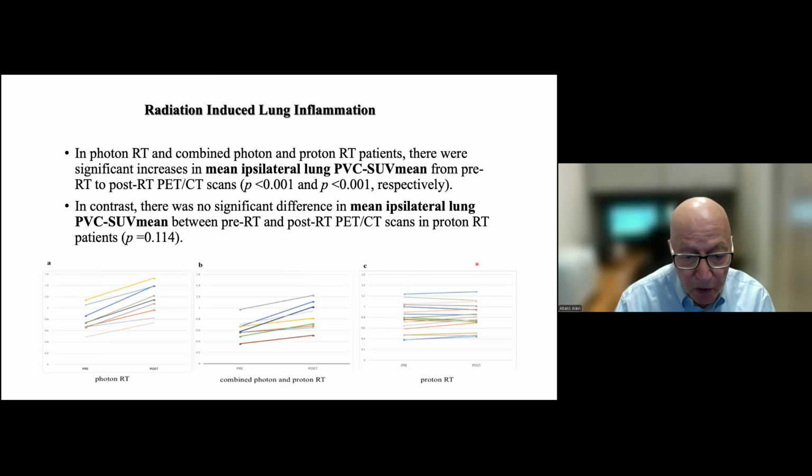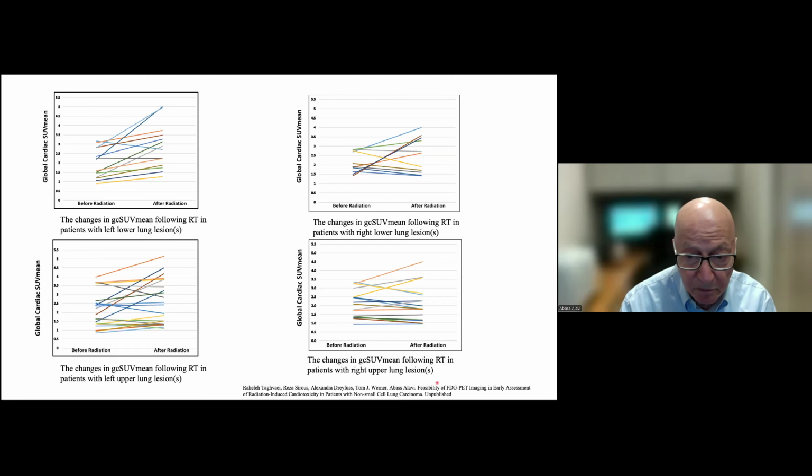This is, of course, showing you photon therapy, conventional X-ray therapy, causing significant inflammation, compared to proton therapy causing less inflammation, and for sure, proton therapy does not cause as much inflammation, and therefore proton therapy seems to be a safer way of treating various diseases and disorders.